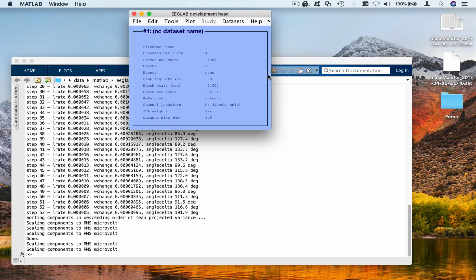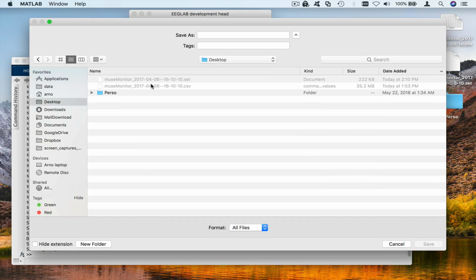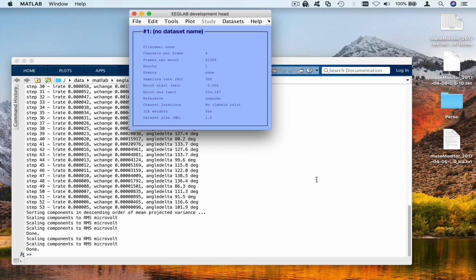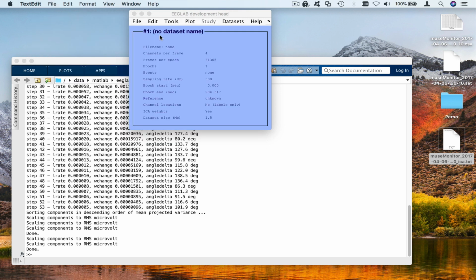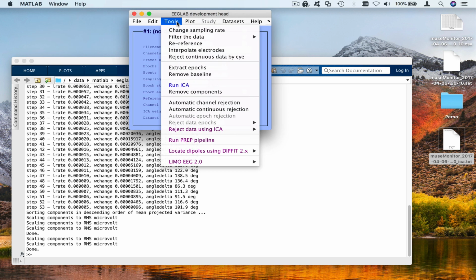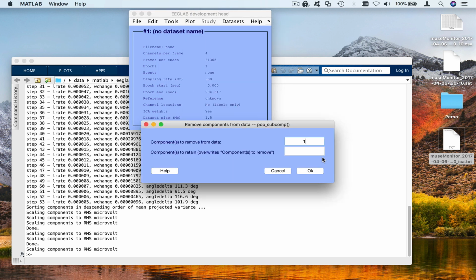So I select this menu. And then you go wherever you had the file, you select the original file, and you're going to say ICA, underscore ICA. And this is going to be a text file. Okay, so it has been saved. If we double click on the file, we are able to see the weights. So that's all good. And we're going to remove, we said component number one. Remove component one.